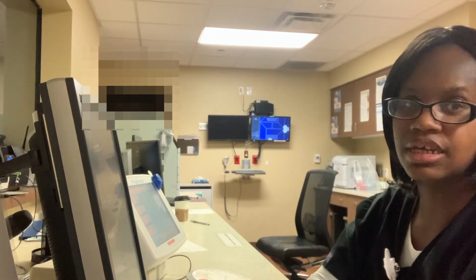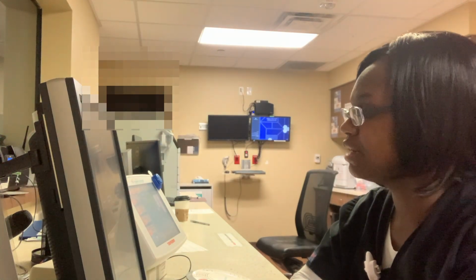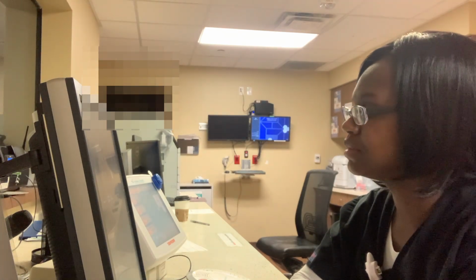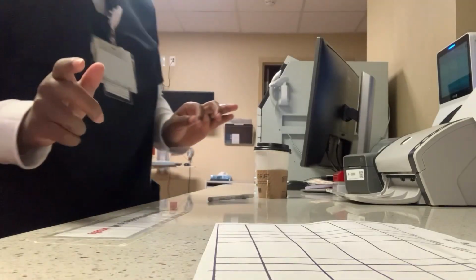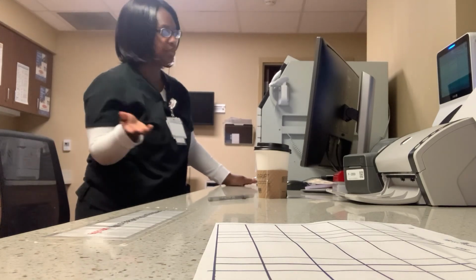So I pretty much just look at all the pictures to make sure that I got all of the anatomy on there. You want to do that before you get the patient up so that they don't have to come back. So that's all. Another big part of the day consists of me scanning in the paperwork.